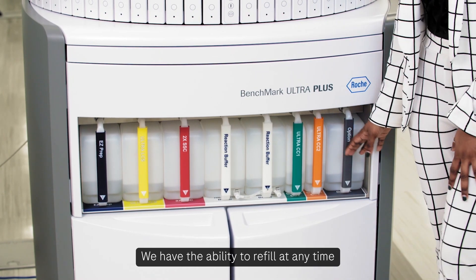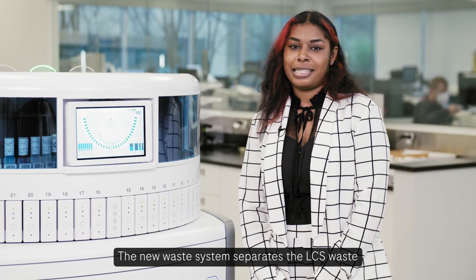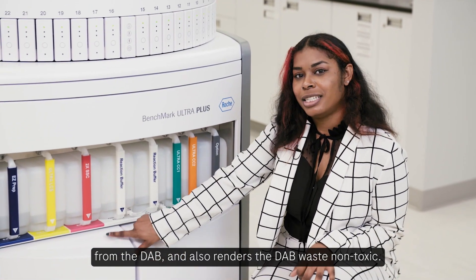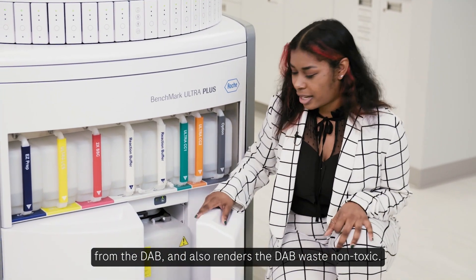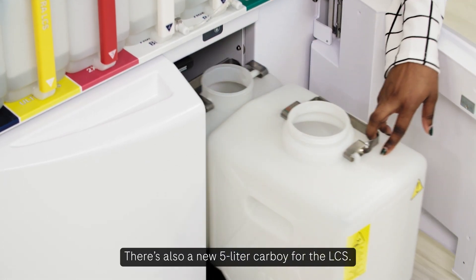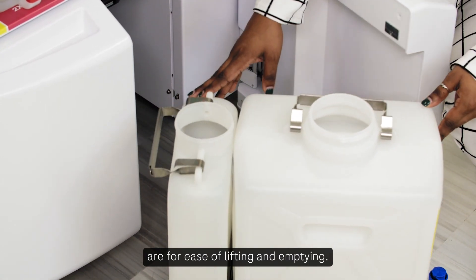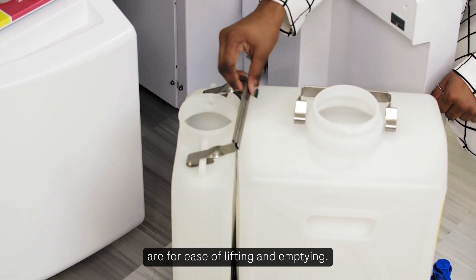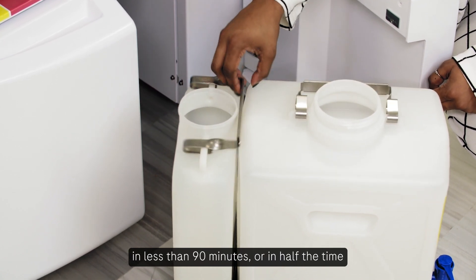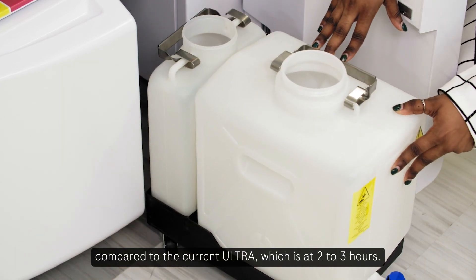We have the ability to refill at any time without any process interruption. The new waste system separates the LCS waste from the DAB and also renders the DAB waste non-toxic. There is also a new 5L carboy for the LCS, and the ergonomic waste container handles allow for ease of lifting and emptying. The new pumps allow for decon to be completed in less than 90 minutes — half the time compared to the current Ultra, which takes 2 to 3 hours.